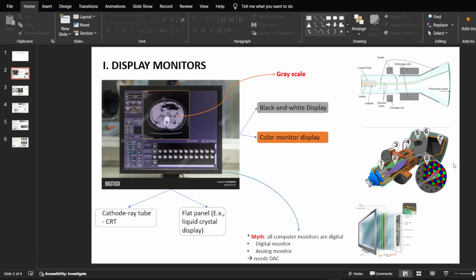So we could use the display monitor from our standard configuration, which is accompanied automatically with our machine, or we can buy it from outside, for example an LG display monitor, display screen, right?